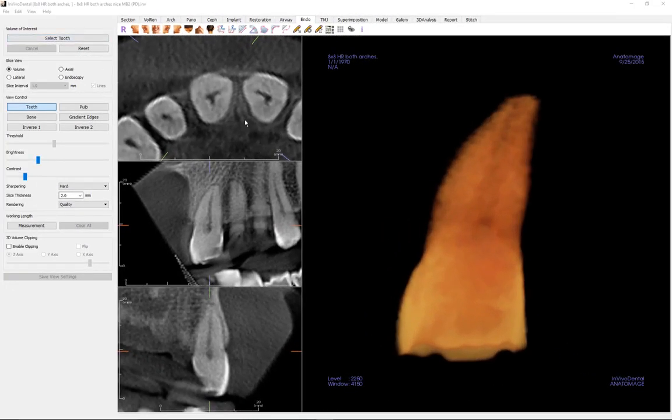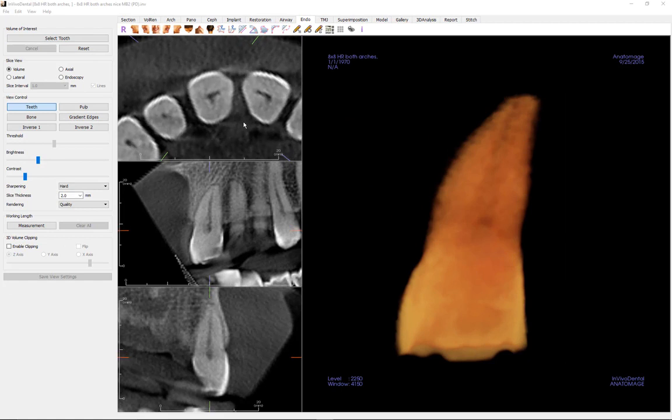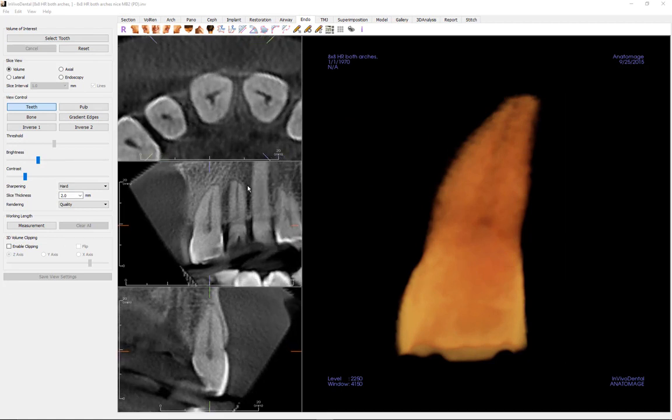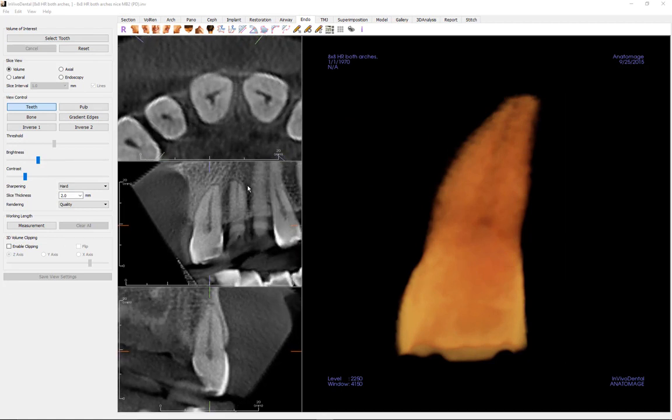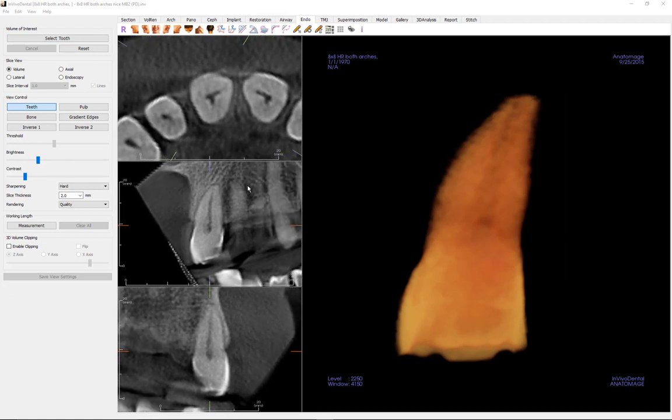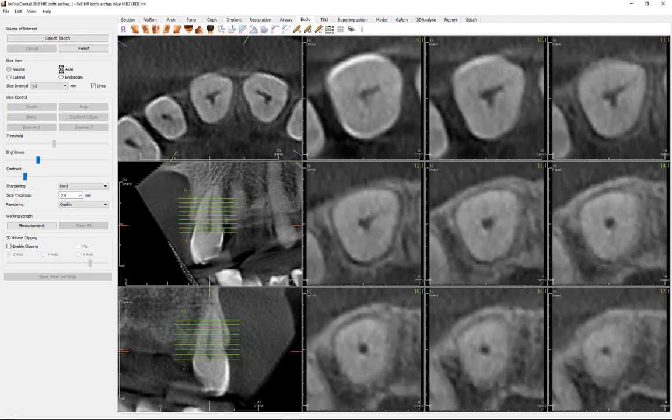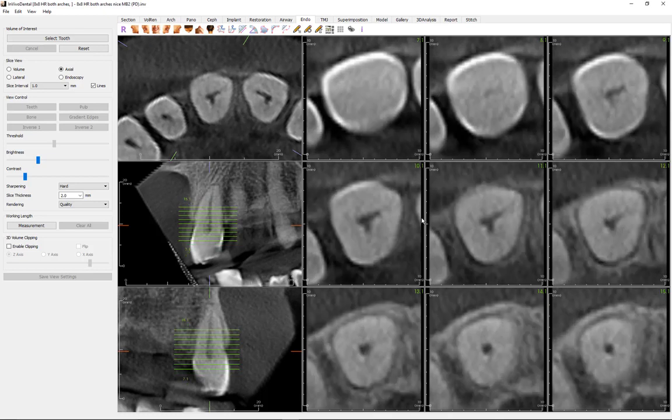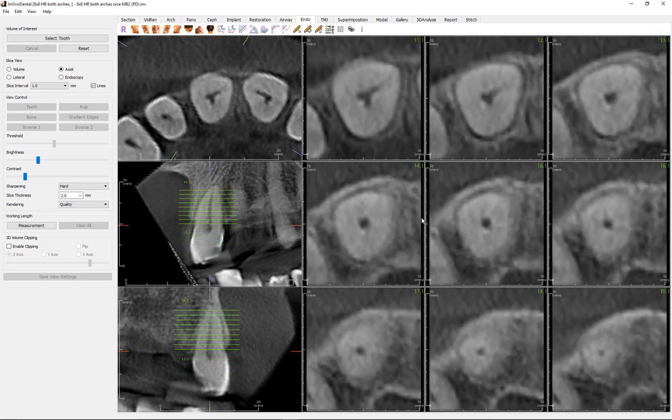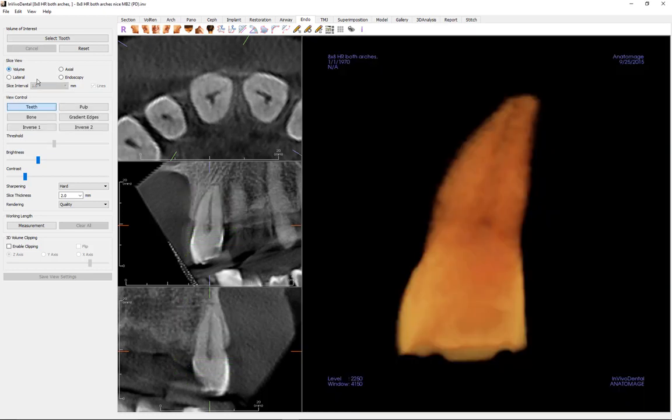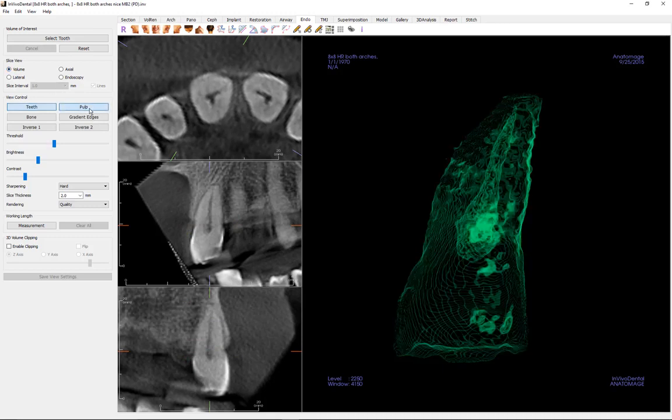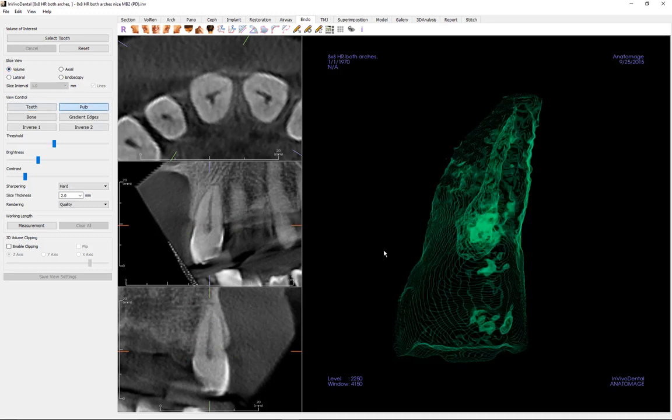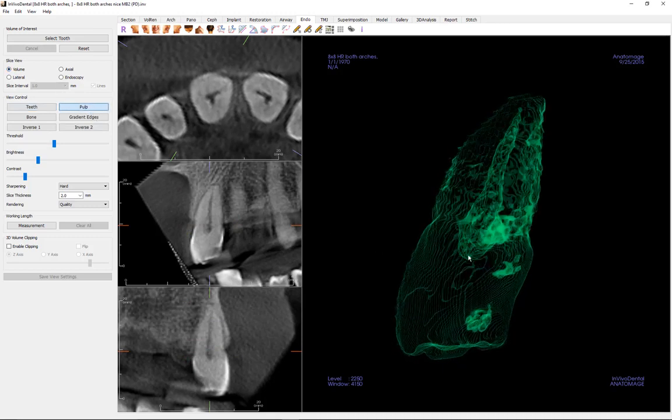After a tooth is selected, you may scroll through its axial and lateral views for a more thorough examination. Once the volume is segmented and the tooth is isolated, the pulp view control may be selected to allow for better visualization of the canal.